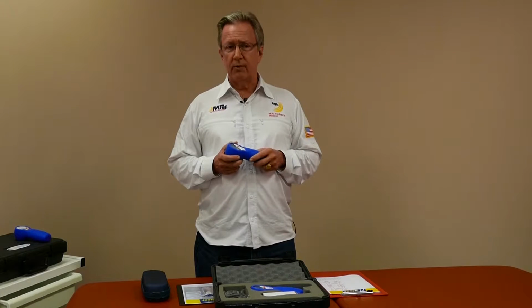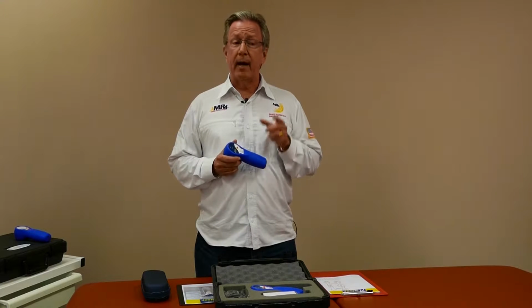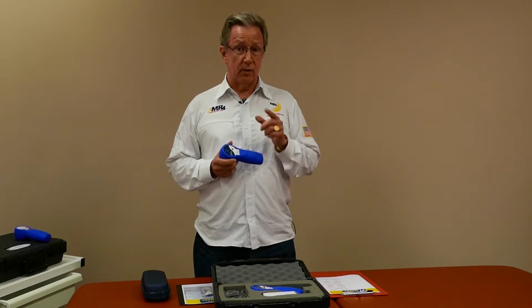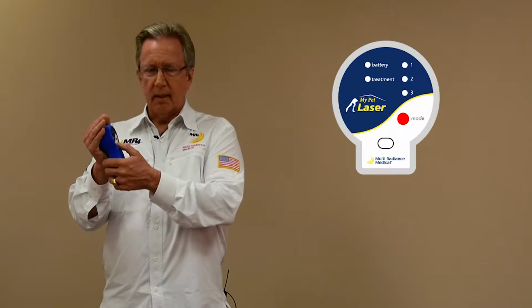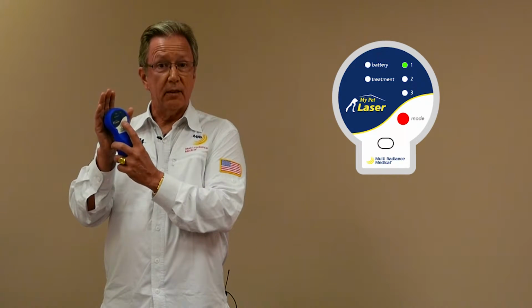So today I'm going to tell you about the operation of our new My Pet Laser device so that you can rent this from your vet, and by all means check on the insurance policy. You may very well find that your insurance policy covers the laser treatments. Isn't that fantastic? So remember, we talked about having your hand over the front. This is very important. And simply holding the power button down until you hear that beep. And then you're ready to select the mode.